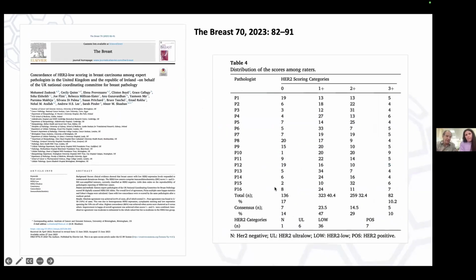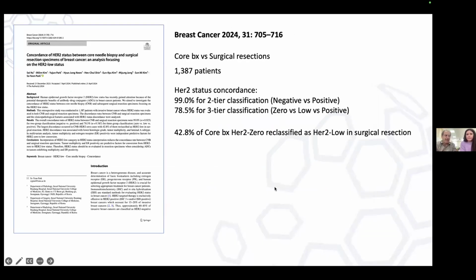We spoke about this. In the low category, we are not concordant, but I feel confident that if we define these categories well, we will be concordant, because we're not idiots, if you tell me how to score things and how to interpret. So what do you think the biggest problem is? At the moment, proportion.